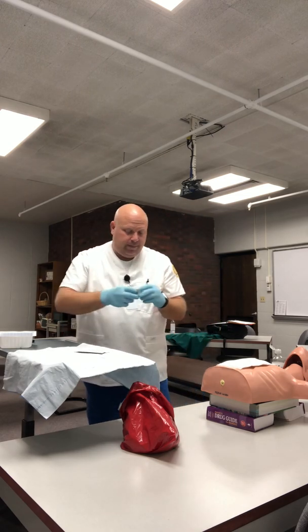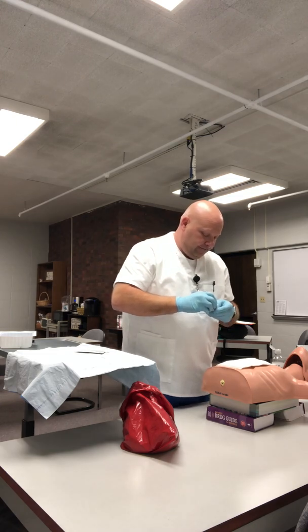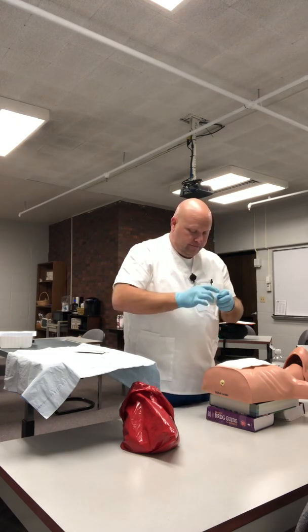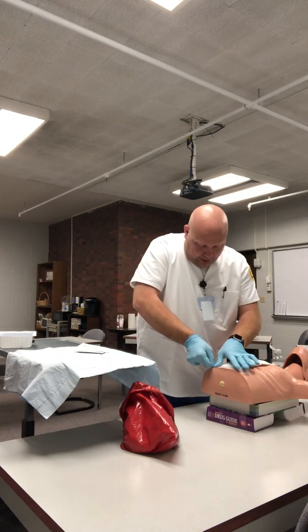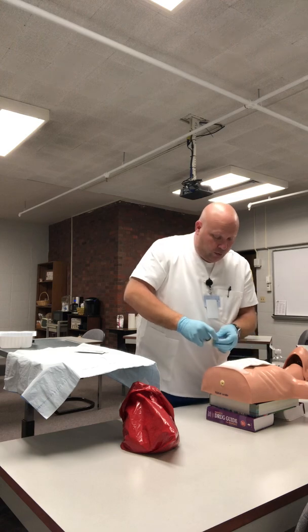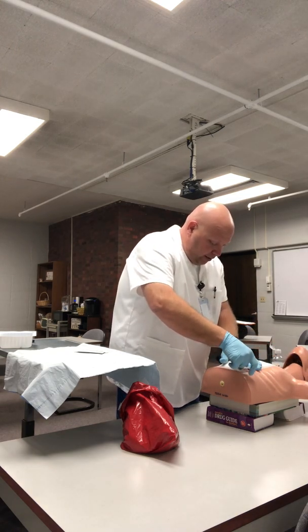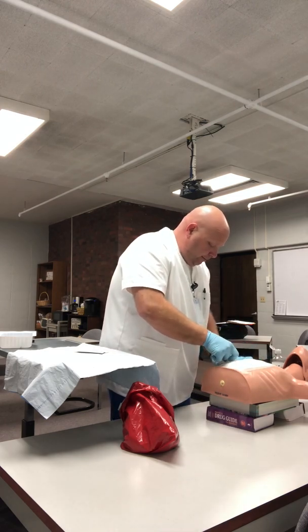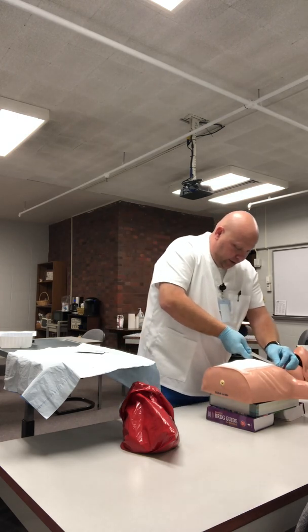I'm going to take my tape and I will secure this bandage. When I break the tape, I will hold pressure. Come down this side. Down this side. And across the top.